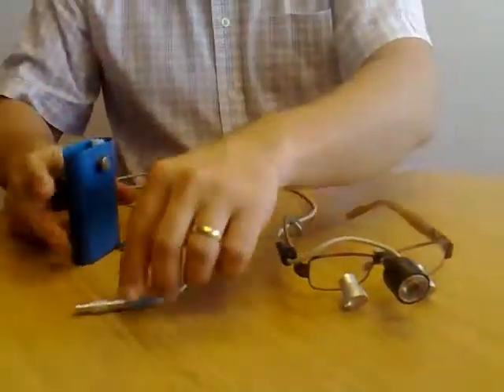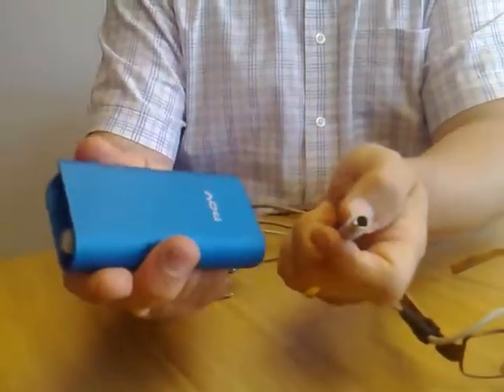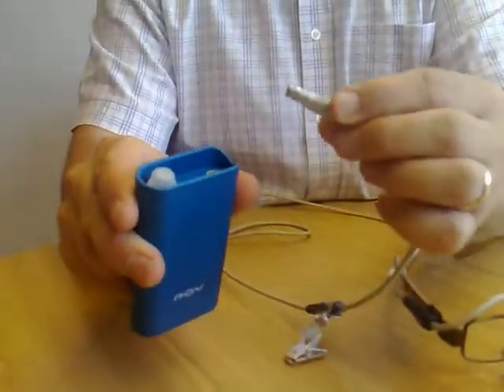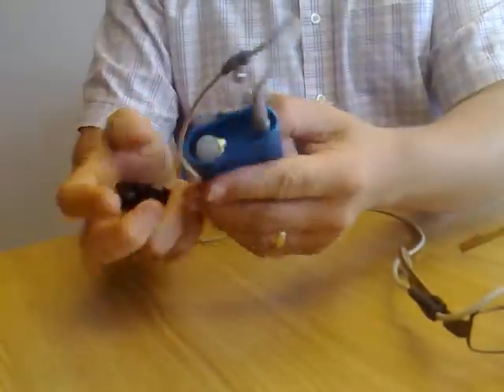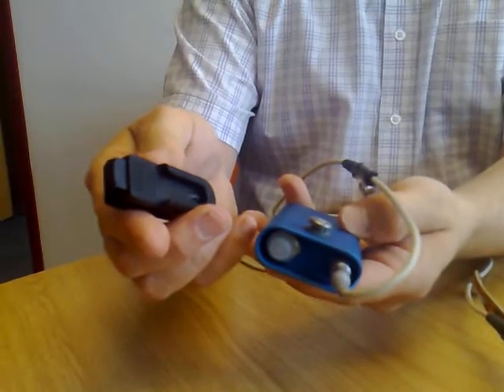Basically how the thing works is, this is a little POV unit. This is a rechargeable battery in here which you use to charge up. It's got a light switch here and we basically plug in here. It comes with various clips, but this particular one has got a clip so it can go onto a buckle.